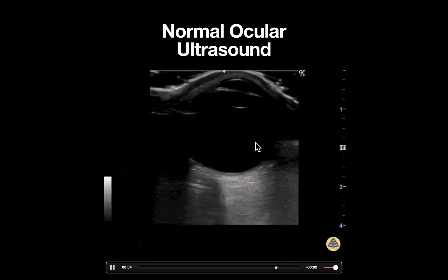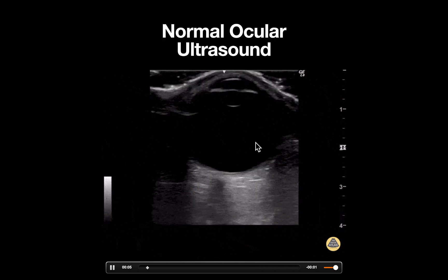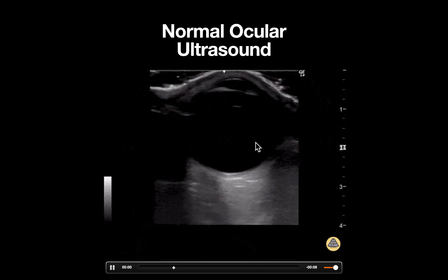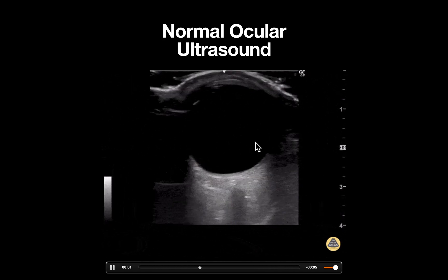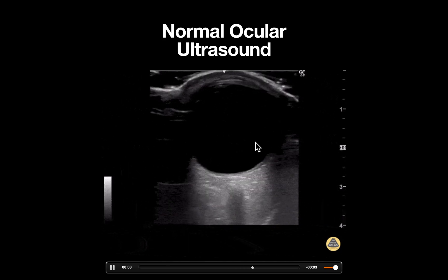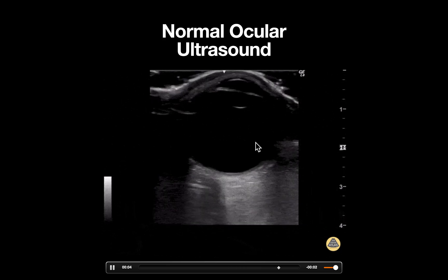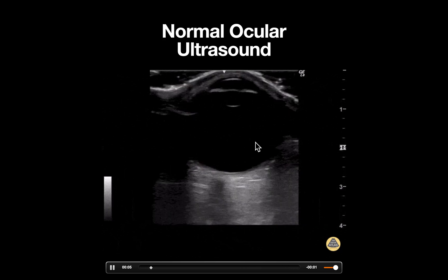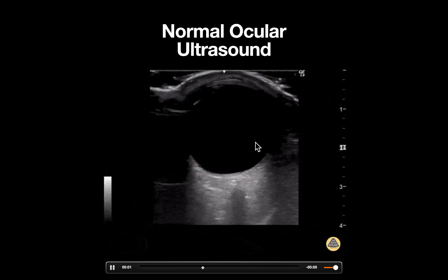Slight fanning movements can also be performed to evaluate the entire eye. This process should then be repeated with the probe in a sagittal orientation to complete the exam.